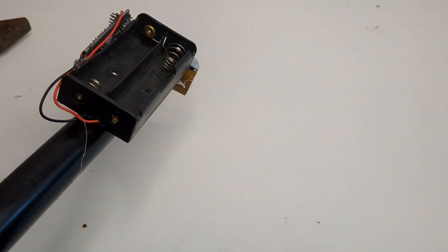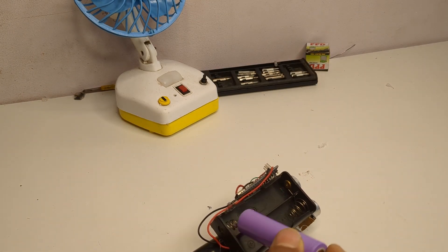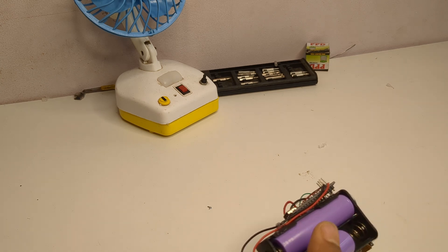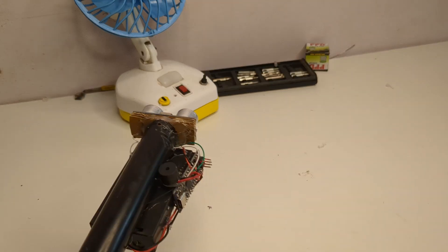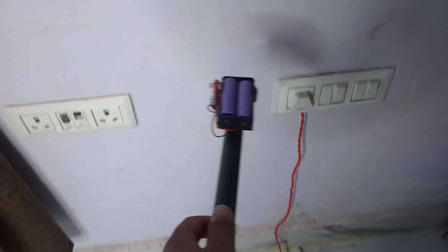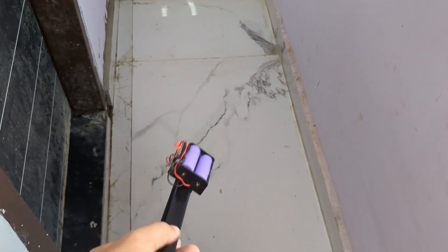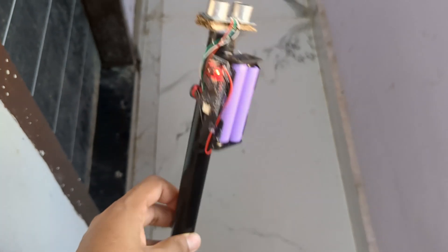Finally, the smart blind stick was ready. I inserted the batteries and tested it. When anything came in front of the sensor, the buzzer turned on and gave a warning sound, so the user knows there is something in front of them.